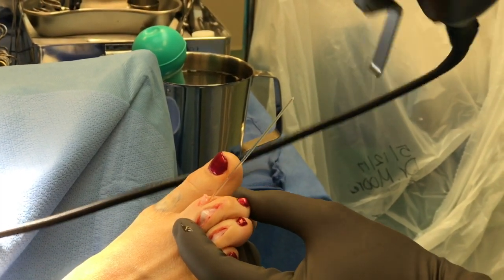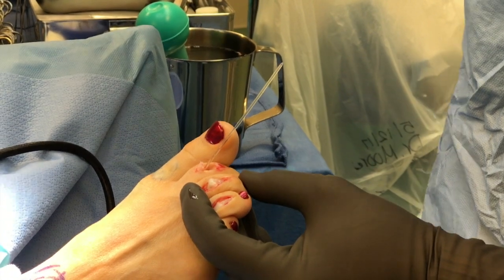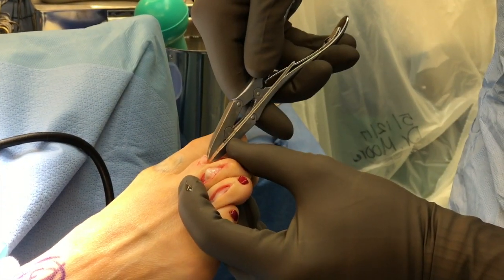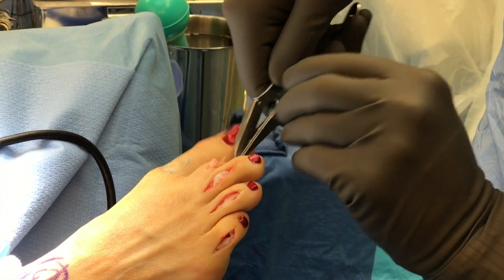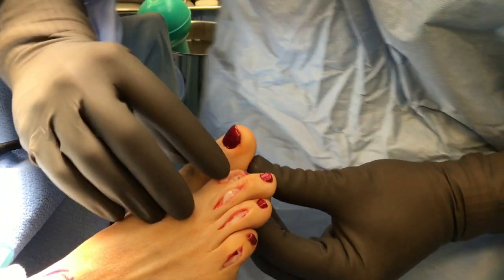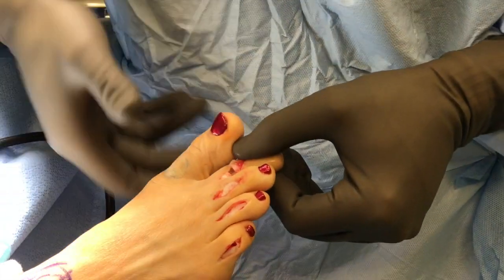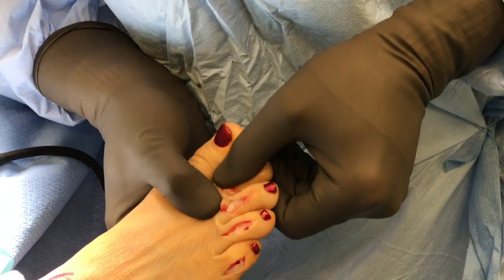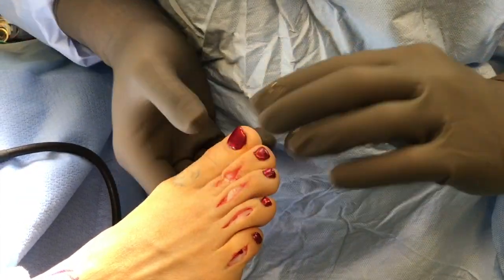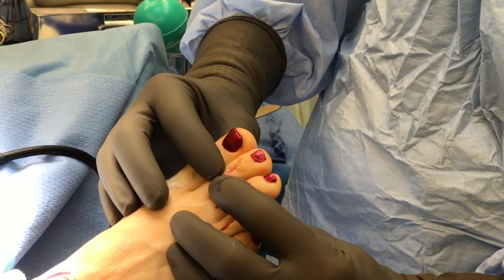With the bone cutters, we fashion this portion here to put into the end of the bone. I already have another portal drilled on this side. You fashion the tip in here, lift the toe up straight, press fit — and voila, a shorter, straighter toe that when we close will look just beautiful.